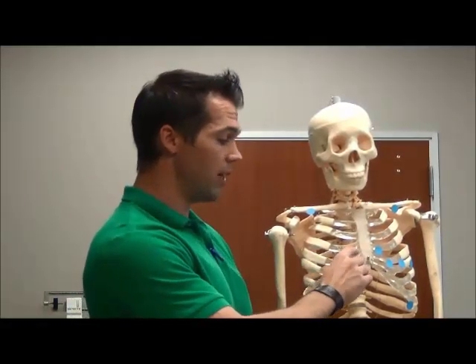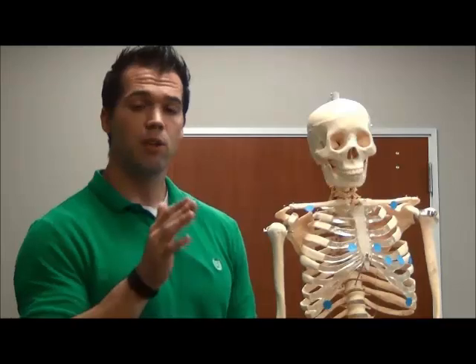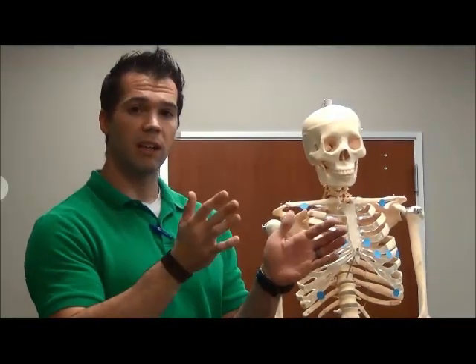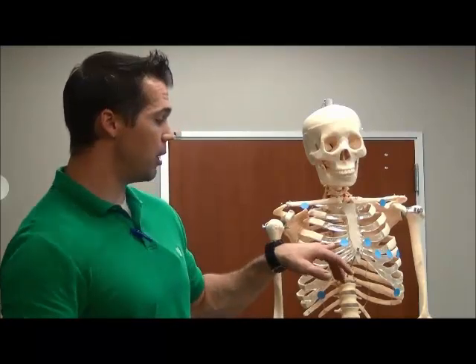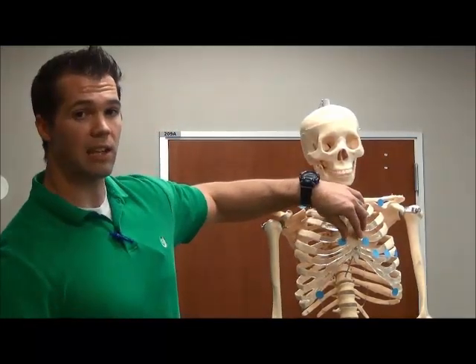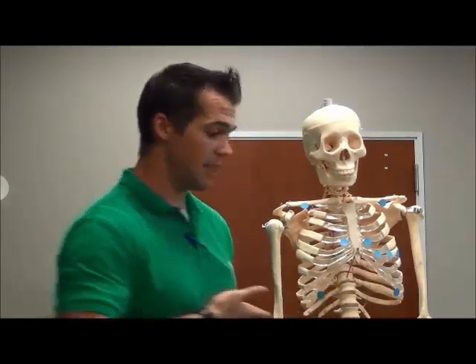You place V1 and V2 in the space in between the bone. That's an important thing to note. If you place an electrode directly on bone, when you go to look at the reading, it won't look the way that it should. We call that artifact. It'll be bouncing a lot. So you want to miss bone. So you have V1, V2, and the fourth, we call that the intercostal space, in between your intercostals. And then you have V3, 4, 5, and 6. It wraps the chest around.